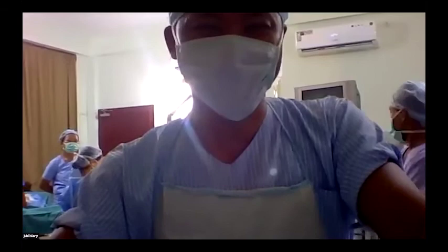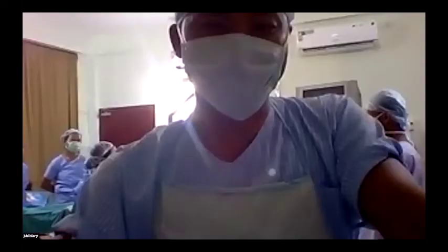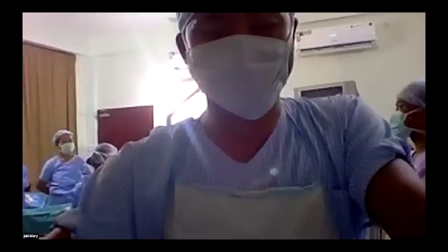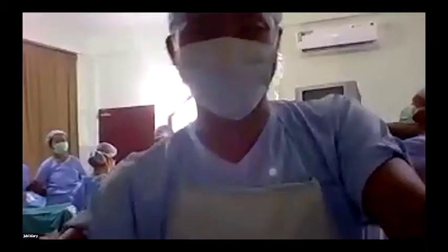You want me to do GILLS? Yeah, you can try. Have a look inside, and if you think it's too much, you can't proceed. It is very difficult because the mass itself is up to the umbilicus. Yeah, it's okay. Once you decompress, it should not be a problem. You can show it to this live one. Sure, I'll try with GILLS.